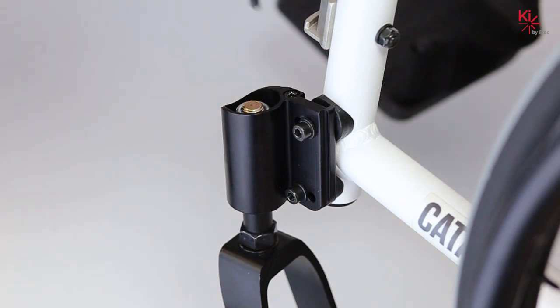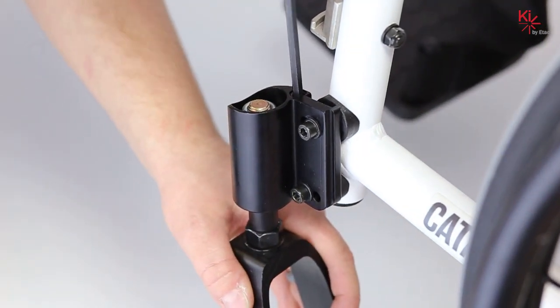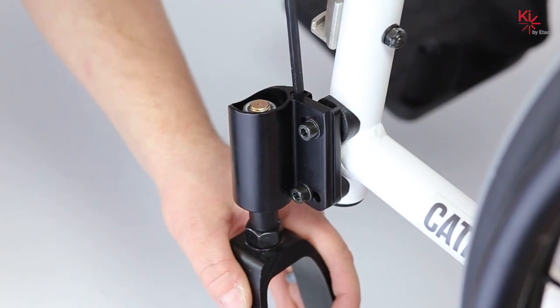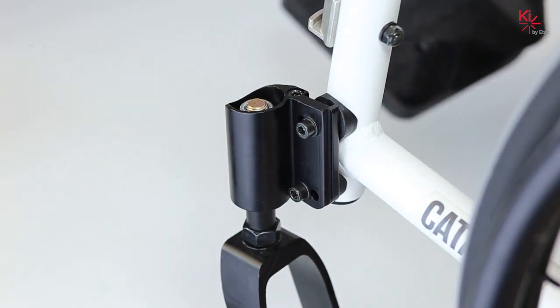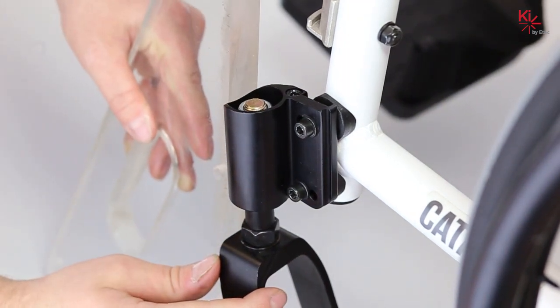Using the five millimeter allen key turn the adjustment screw in the direction necessary to re-square your casters. Once some adjustment is made, using a square against the front of the caster barrel, check for caster squareness.